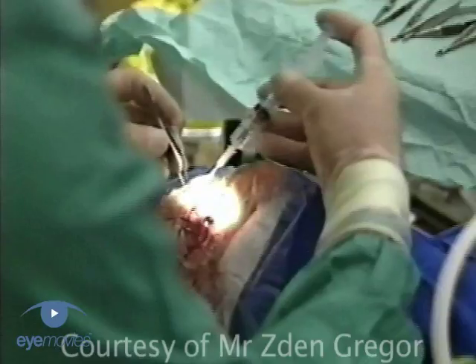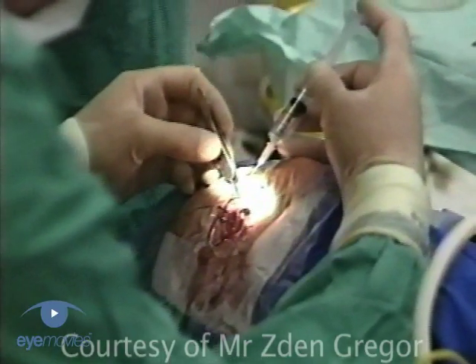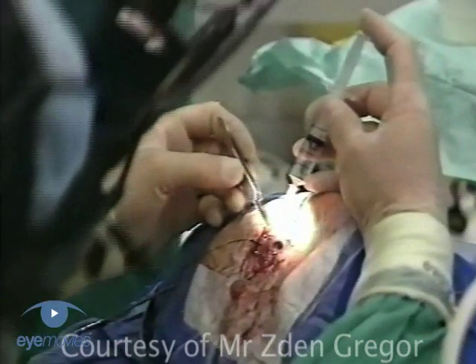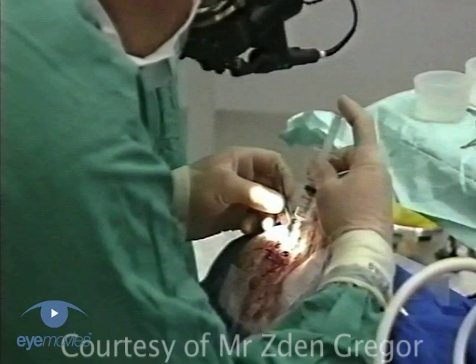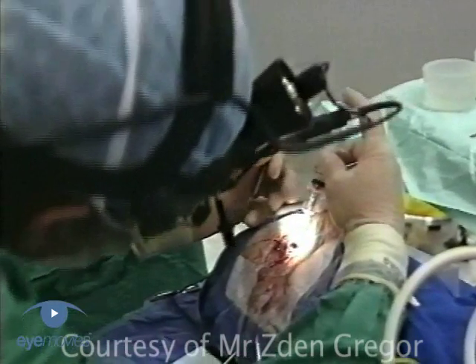Put on an indirect ophthalmoscope and sit down on the temporal side of the patient. Place a 30-gauge needle on a syringe. Measure 3.5 mm in a non-phakic or 4 mm in a phakic eye from the limbus nasally.